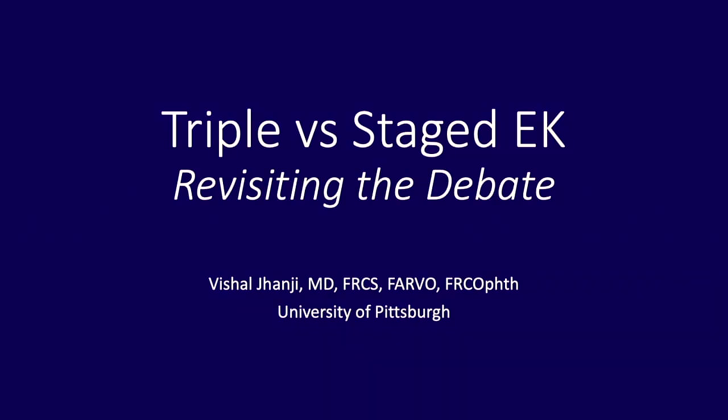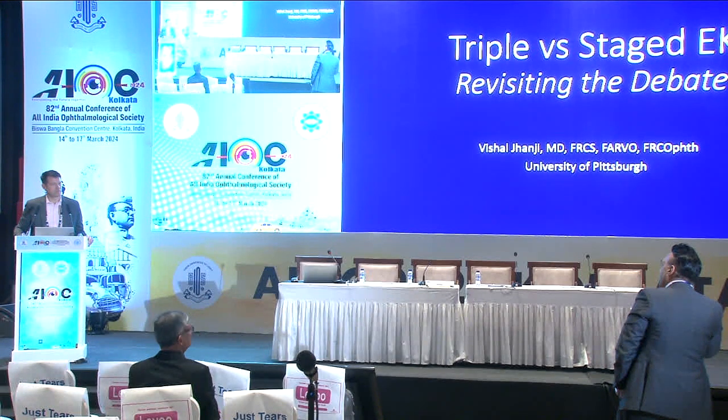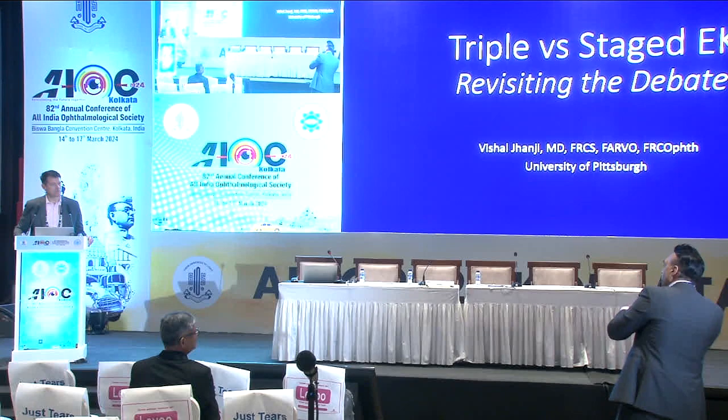John. Tony, great talk. The prolapse issue is the insertion technique. If you do endo in, you won't get that. Because Divya asked me when she came to Singapore, how many cases do you do mixed? And I do all my combined cases. But I've never had that issue because the AC is completely deep when we pull the graft in. It's a technique issue because when you're doing endo out, you're shallowing the AC.